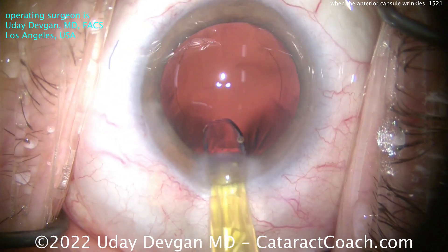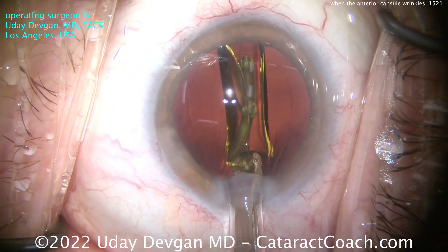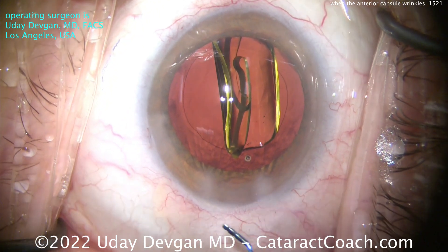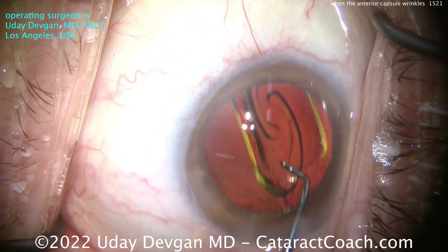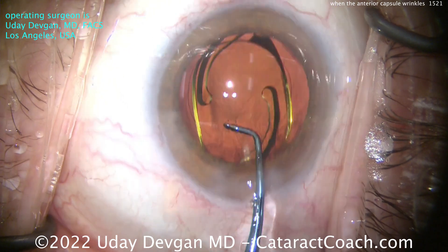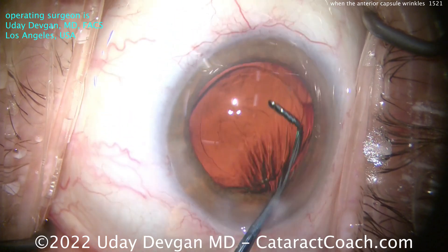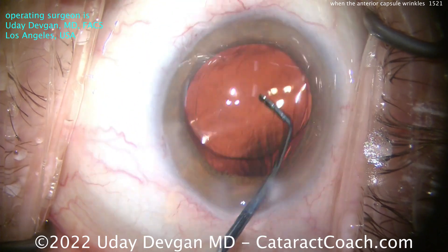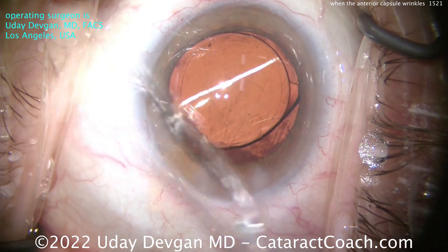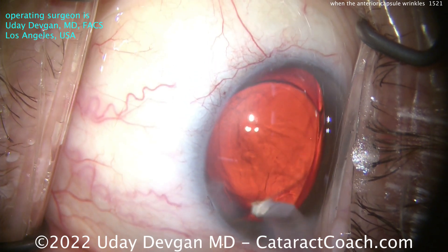Let's get the IOL in — a single-piece acrylic lens going in the capsular bag. Inject it in there, let it unfold and open up, and put it into position using the chopper. Now you can see why that rhexis is on board. If you did have more zonular laxity than this, you could put in a capsular tension ring, especially if it was focal zonular laxity — that'd be a good idea. You need an intact capsular rhexis in order to place a CTR. That looks great — a very nice overlap, an almost perfect rhexis, 5 to 5.5 mm rhexis with a 6 mm optic.